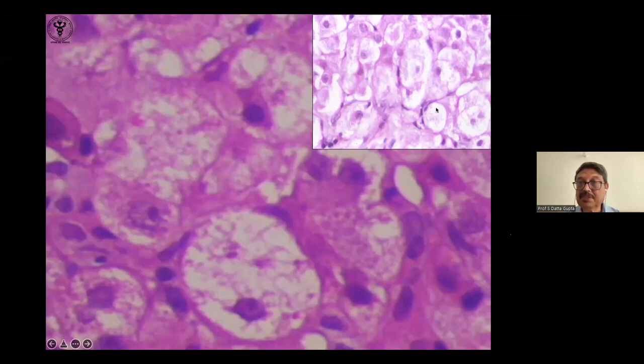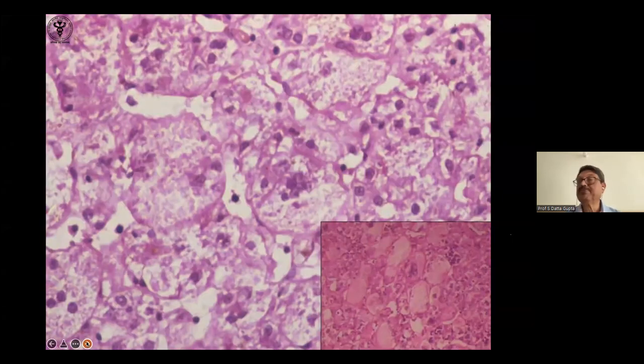Now, in some cases, the cell does not increase in size, and there are wisps of cytoplasm here, what people call feathery degeneration. It is very difficult to distinguish between ballooning and feathery. The only change people mention is that in feathery, the cells are not as enlarged as in ballooning. And in feathery, you may get some bilirubinostasis within the cells, and that's why feathery degeneration is almost restricted to biliary obstruction. But anyway, there are no marks if you cannot distinguish between the two.